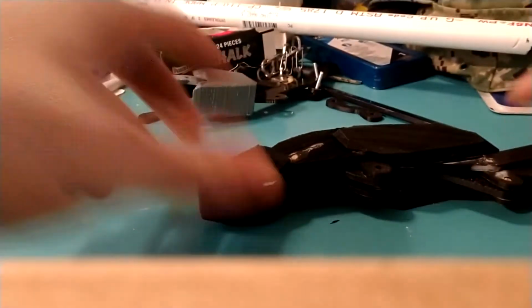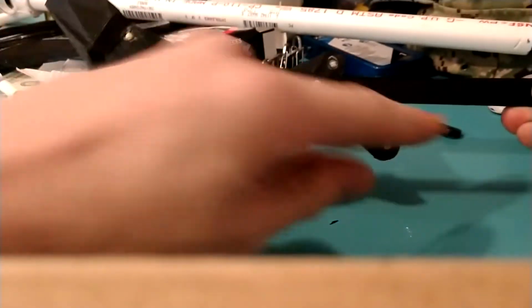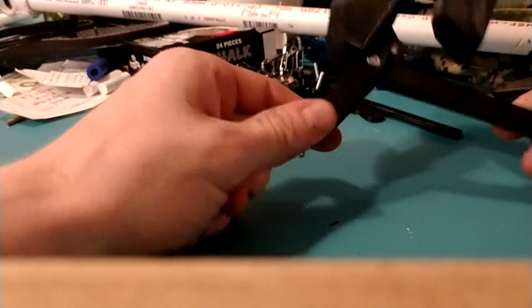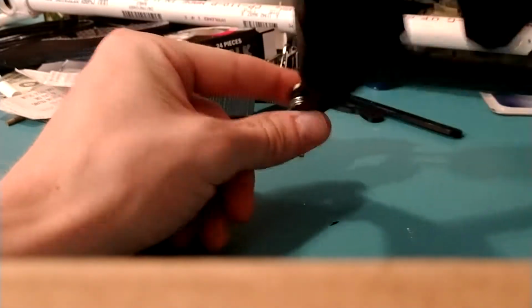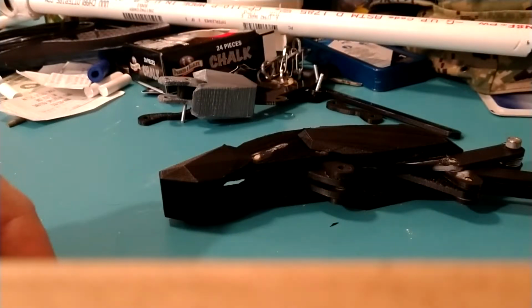So how it works is you simply push forward to open the finger, and then you'll pull back to close the finger. This piece right here will be mounted. So that'll be kind of like mounted on a swivel, and then it'll just move forward and out. There's no springs or pulleys or anything like that in here. So hopefully that was helpful. If you have any questions, ask me.